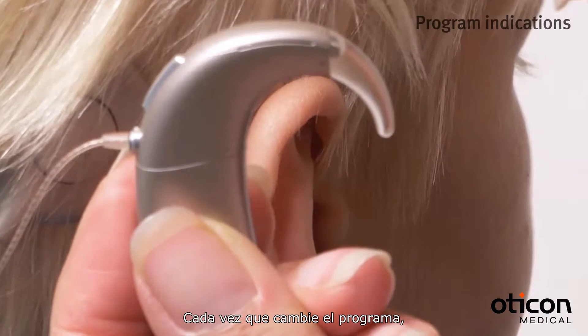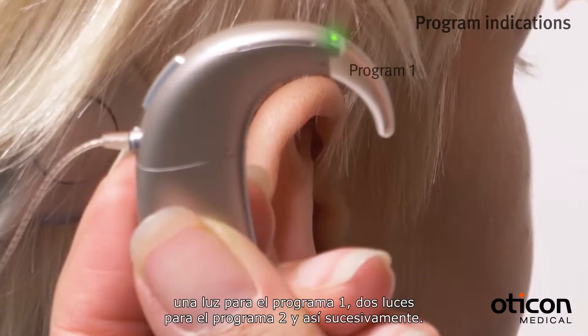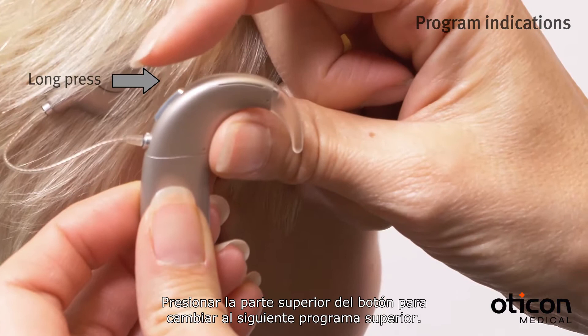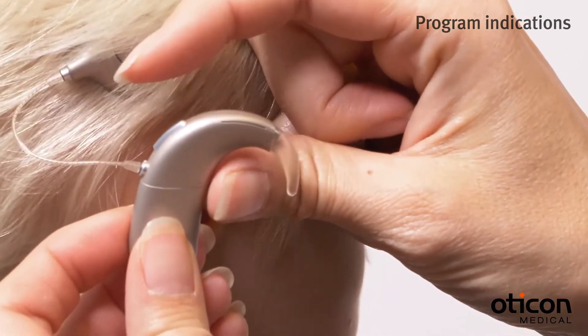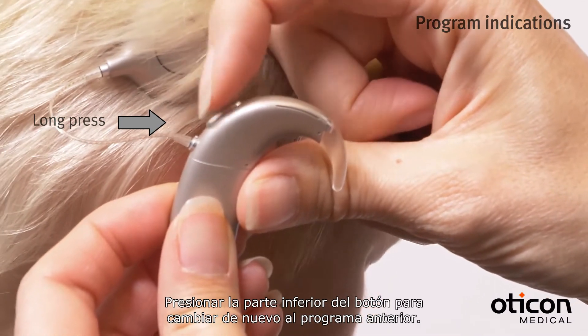Each time you change the program, you will see a number of green lights to indicate the selected program: one light for program 1, two lights for program 2, and so on. Pressing the upper part of the push button changes to the next higher program. Pressing the lower part of the push button changes back to the previous program.